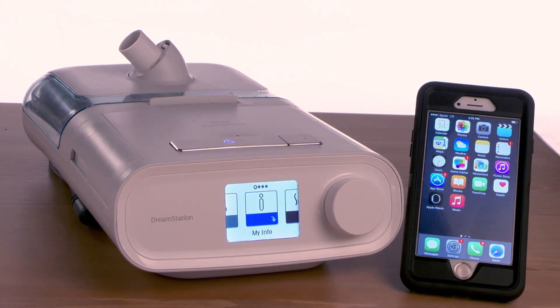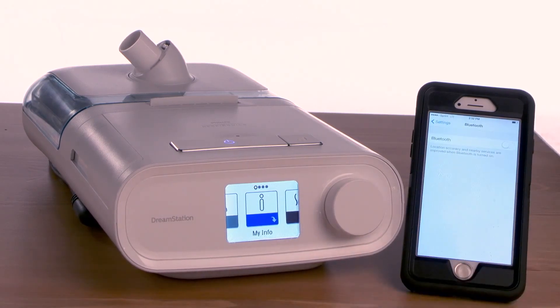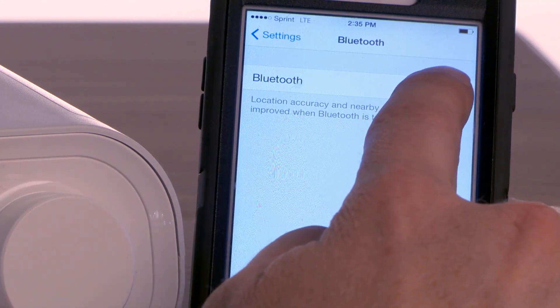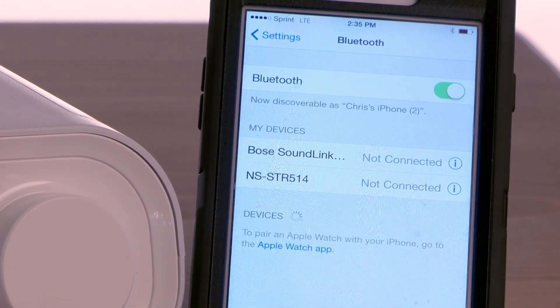The first step is to go into your phone's settings and select Bluetooth settings. Slide the button in the Bluetooth settings to the on position. You will know it's on when it turns green.